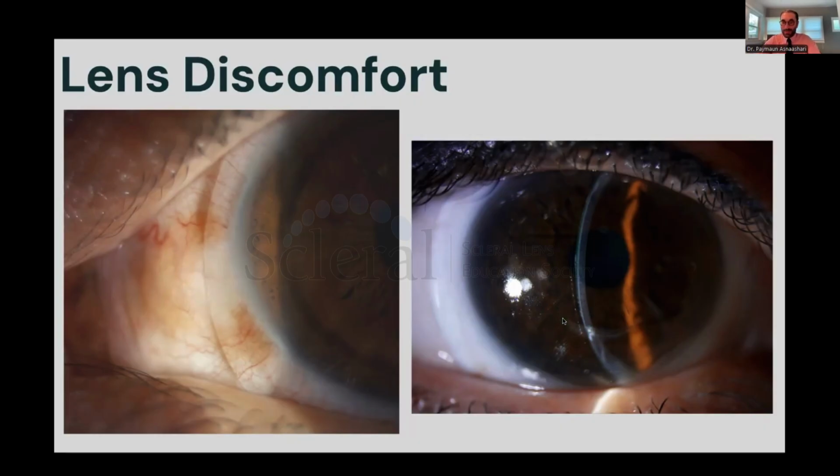So it's sometimes good to just go down to basics and put fluorescein in because it's really nice to have advanced imaging and it becomes valuable at times or a lot of the times. But your simple fluorescein can help so much. And so this patient on the right complained of discomfort as the day went on. And when I started to look at things more carefully, I noticed that there was no clearance from the mid-peripheral parts of the cornea down to the edge of the limbus.